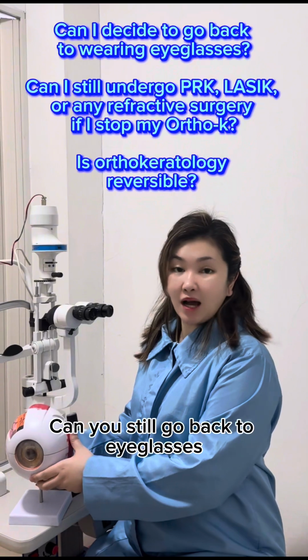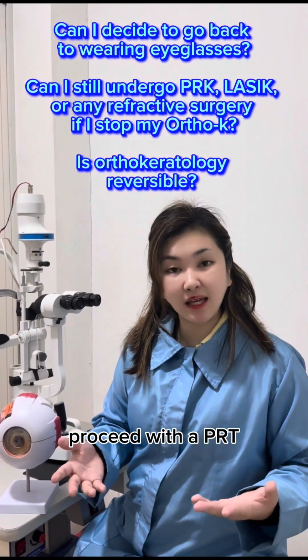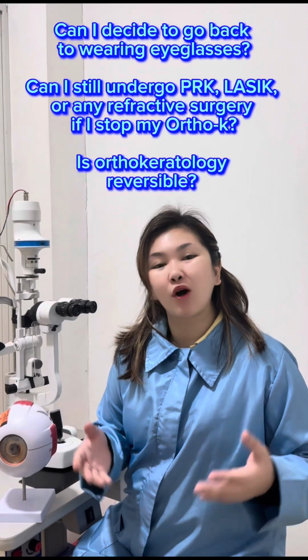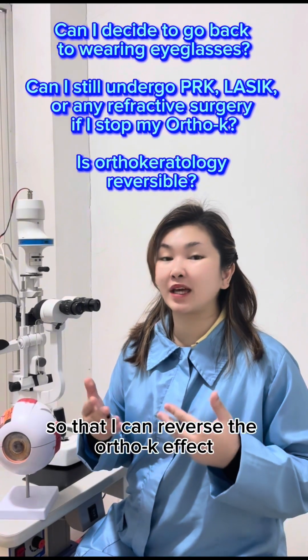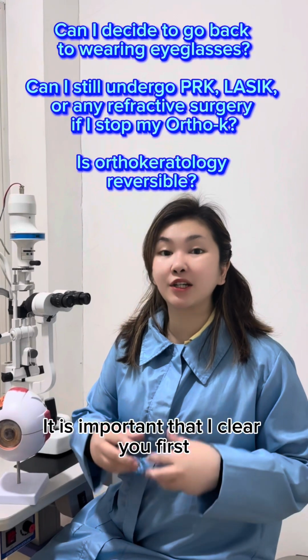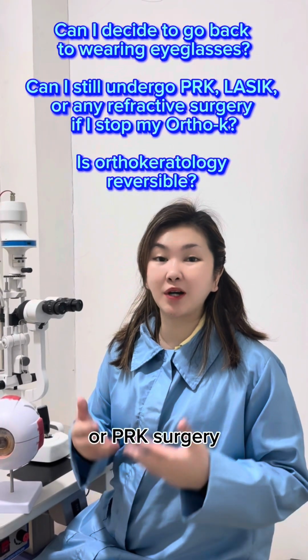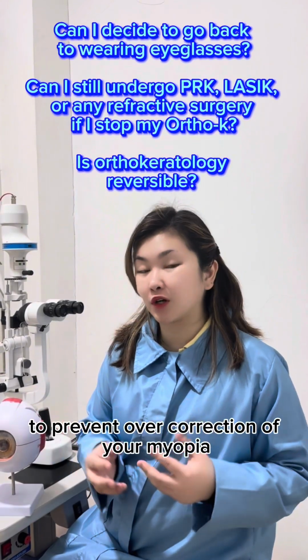Can you still go back to eyeglasses? Or can you still proceed with a PRK or a Lasik surgery after you've done orthokeratology? Yes, we can do that. All you need to do is tell me so that I can reverse the Ortho-K effect slowly but surely. It is important that I clear you first before you proceed with an eyeglasses order or before you undergo Lasik or PRK surgery to prevent overcorrection of your myopia.